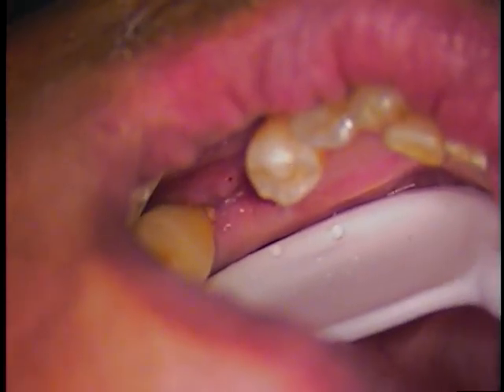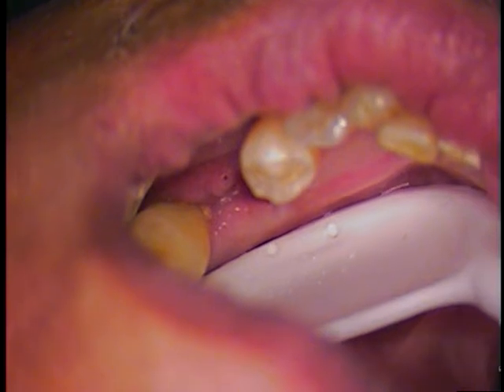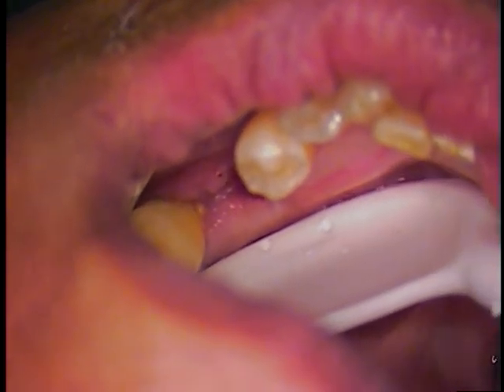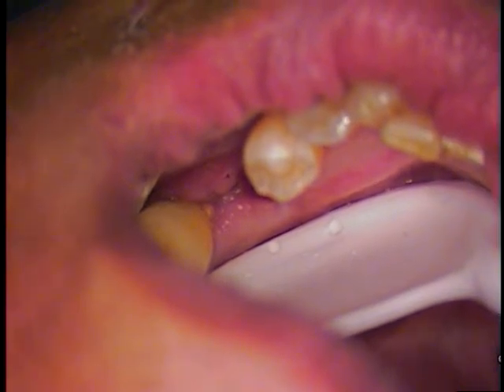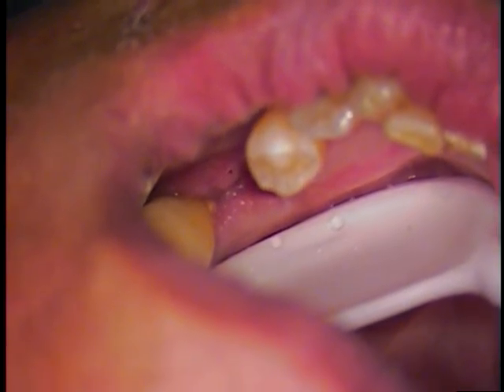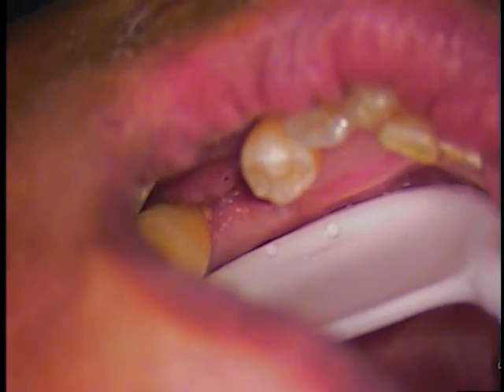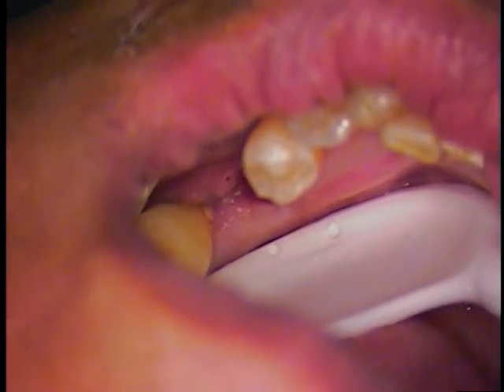I'm going to do one more thing. I'm going to put on here a small little device. Let's see if I have them here. Air water syringe tip. There we go. We're going to switch out our air water syringe tip.